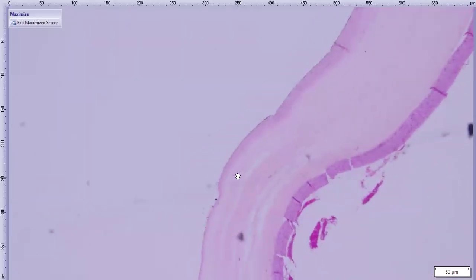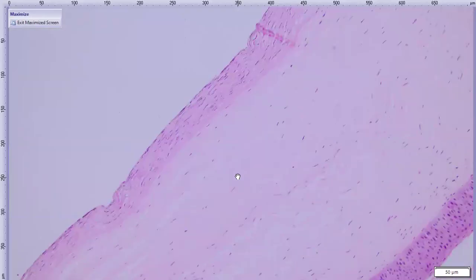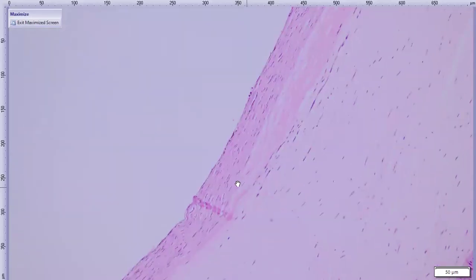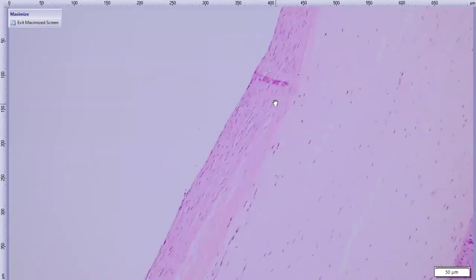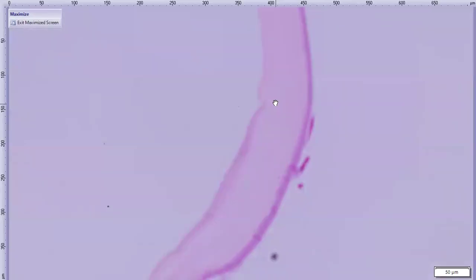Here's another one starting up here, for example. So we have retrocorneal fibrosis overlapping the intact Descemet's, and then if you go far enough, there's eventually this break. And then that fibrosis blends into the corneal stroma and the gap. And there's the other end. So multifocal breaks in Descemet's with a really robust deep corneal fibrosis.